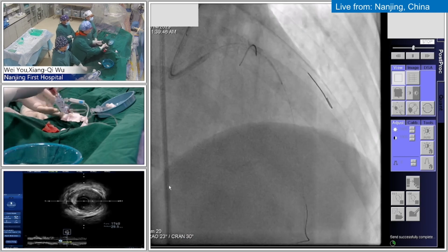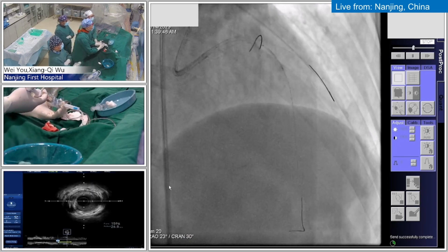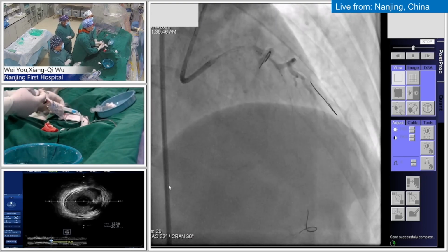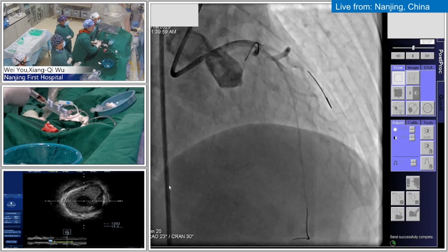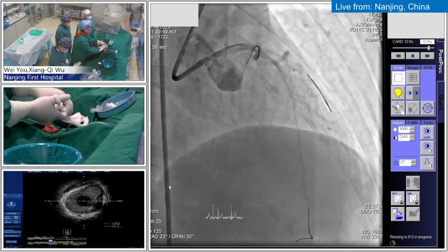So this is just nearby the middle segment. Yes, please. Okay, maybe a bit more, right? Okay. Take the picture, please. Wait a moment. Okay, ready. Take picture. So, Professor, I think here is good, right? Yeah, looks all right. Okay. Go.